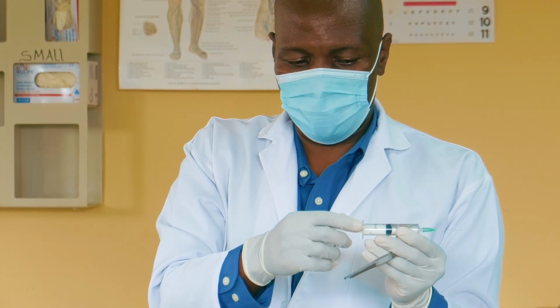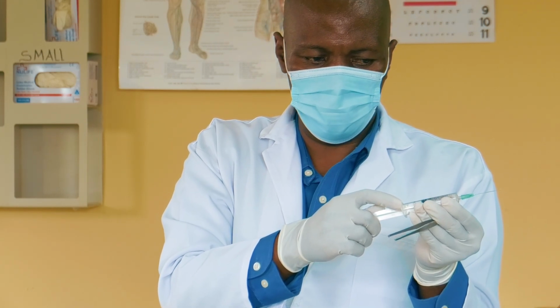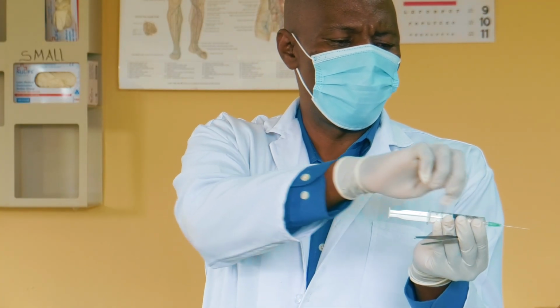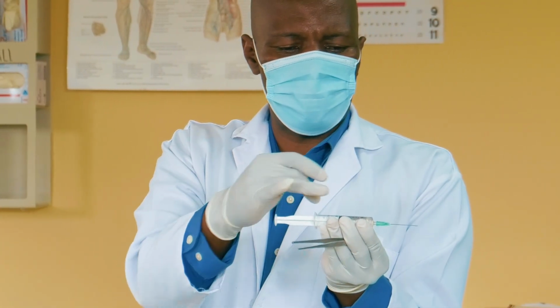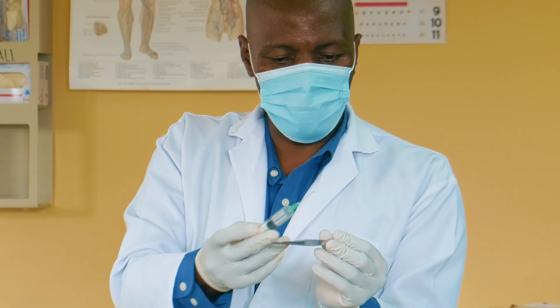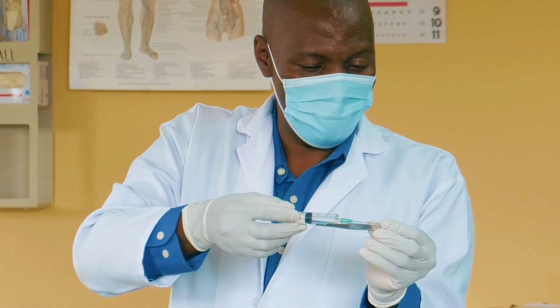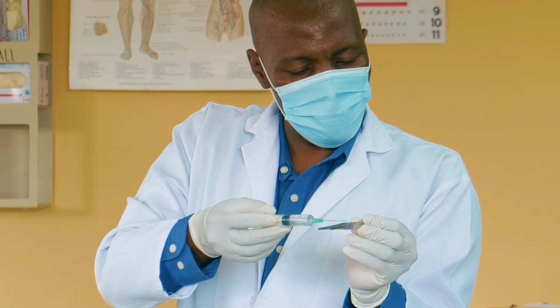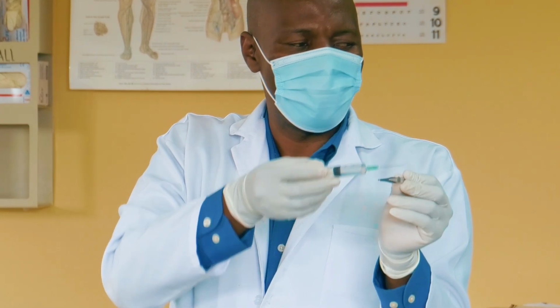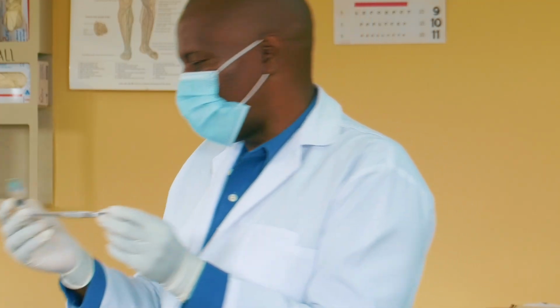So that's the reason I will withdraw first, check that it's not in a blood vessel, then push the drug if it's not. If I'm in a blood vessel, blood will come in. If I'm not in a blood vessel, nothing will come, so then you can. It is called local infiltration. If this is the area that I'm supposed to put in, I'll push here, inject, withdraw, go on the other side, push in, withdraw, check if I'm in it. Whenever I go into the tissue, I have to ensure that I'm not in a blood vessel. So all around the wound, we call it local infiltration. That's what is happening here.